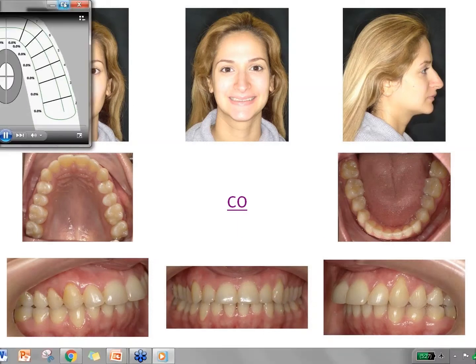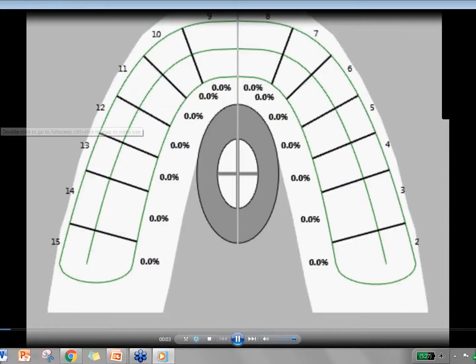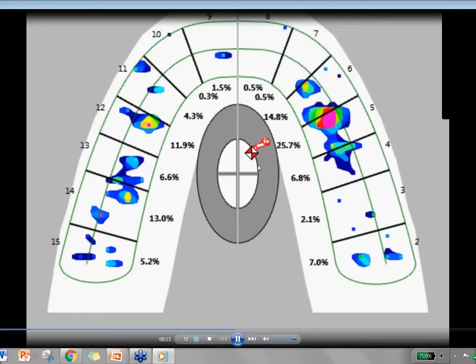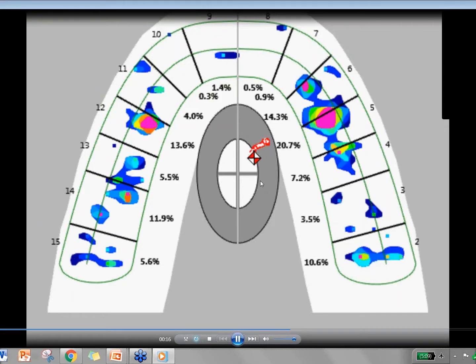I don't know if you're familiar with T-Scan, but I would highly recommend you look at it. This analyzes your bite. It's a little wafer. It shows us exactly how the teeth should hit, and when and where and how hard they hit. So you can see she's closing right now. When that little kite or flag appears, that shows us that we have enough force to actually properly be recording.